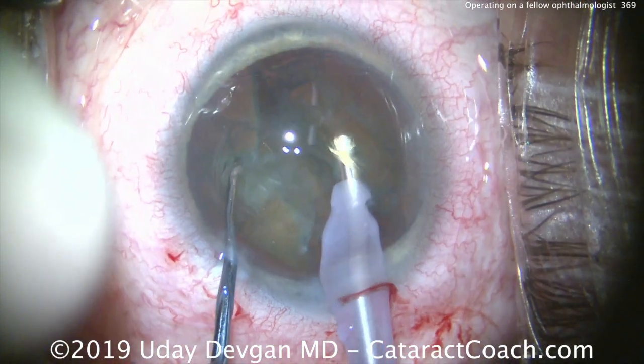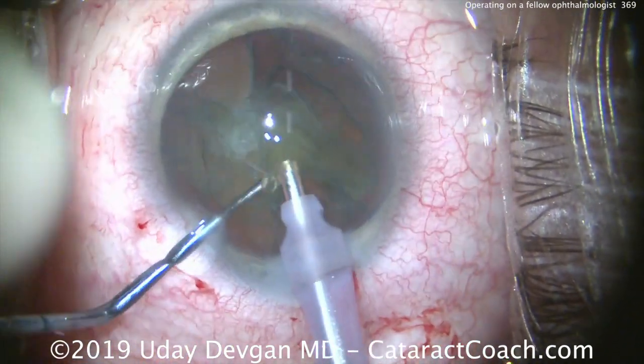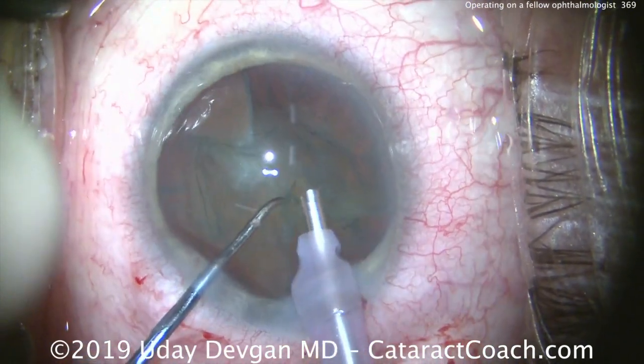Okay, let's finish this first. I'll give the questions at the end. So we'll go chop it in half. And you can see it's not a very dense cataract.